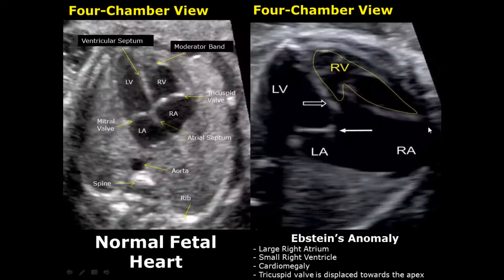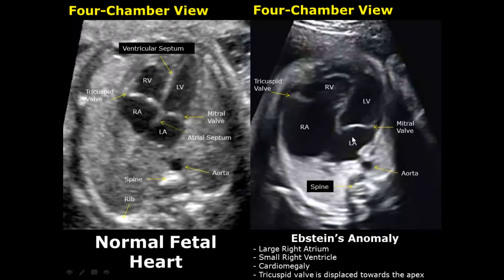In Ebstein's anomaly, there is normally a large right atrium but a small right ventricle, and there will be cardiomegaly. The tricuspid valve will be displaced towards the apex because of the enlarged right atrium. Here is another case of Ebstein's anomaly showing a large right atrium, a small right ventricle, and the displacement of the tricuspid valve towards the apex.